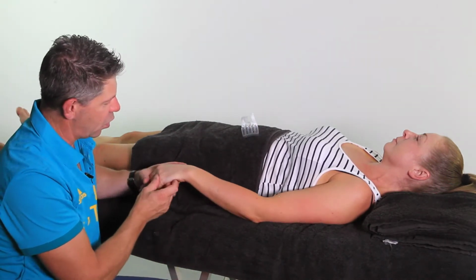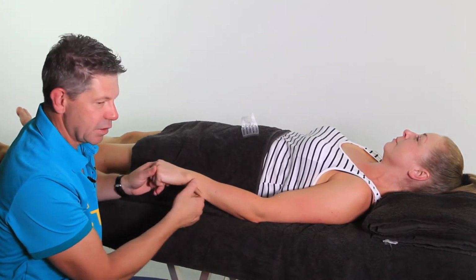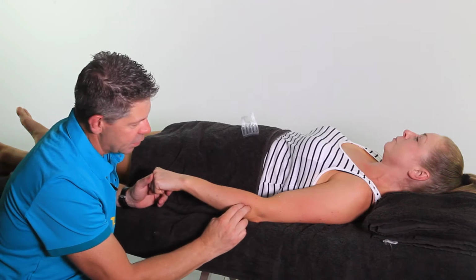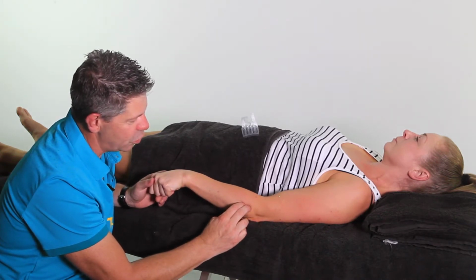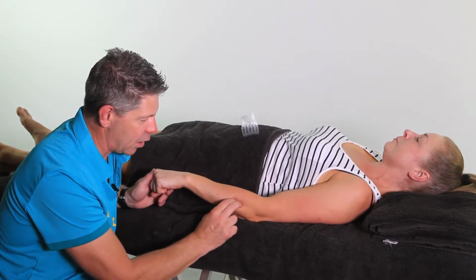So just get your clients to make a fist and then you'll get them to ulnar deviate. So they're going to go out like that. Let's just do that for us, Ali. So you should feel the muscle contract as they do that. That's how you'll know you're on extensor carpi ulnaris, okay?